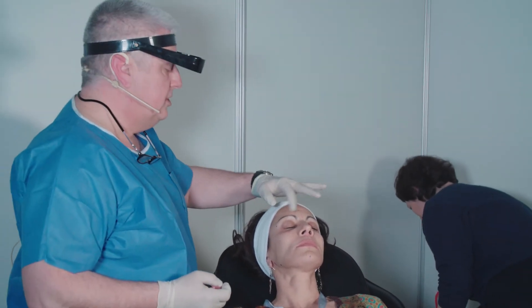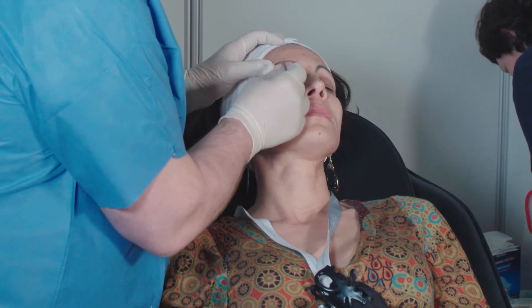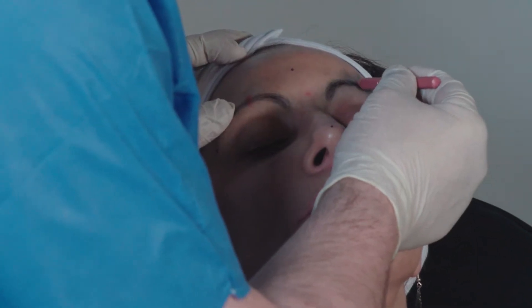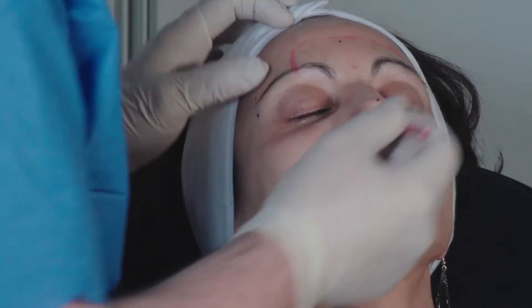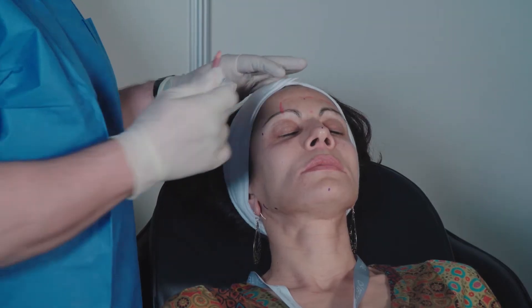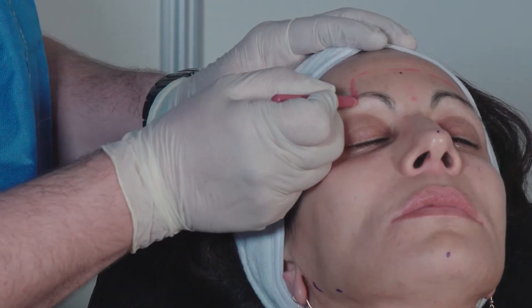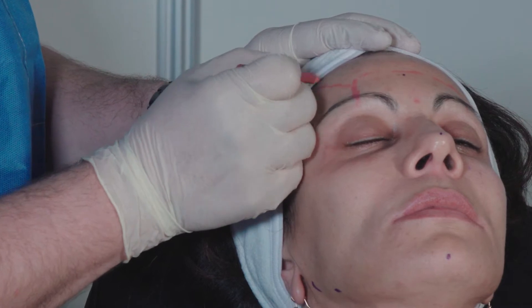In the forehead, we will inject the glabella area. What is the danger zone in the forehead? Normally, just over the pupil, you can imagine you have the external part of the supraorbital pedicles, and the same on the other part. Globally, 3 cm over the orbital rim — this is the danger zone if you inject deep. Remember, all the vessels come from the bone, from the deep position, and they cross all the soft tissue. For example, the supraorbital pedicles are deep here and more superficial laterally.